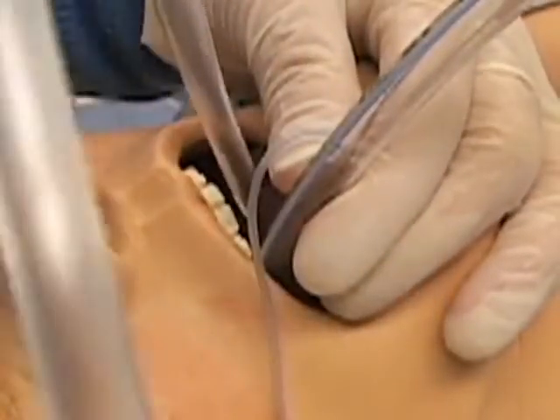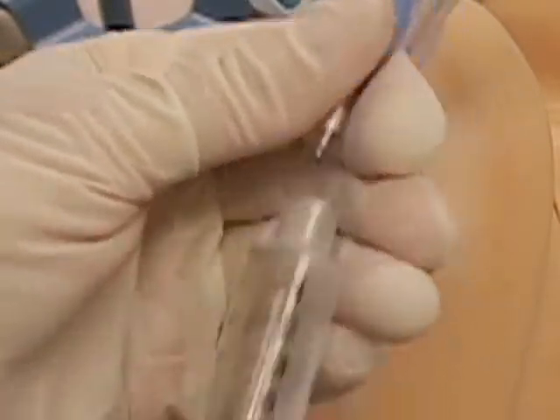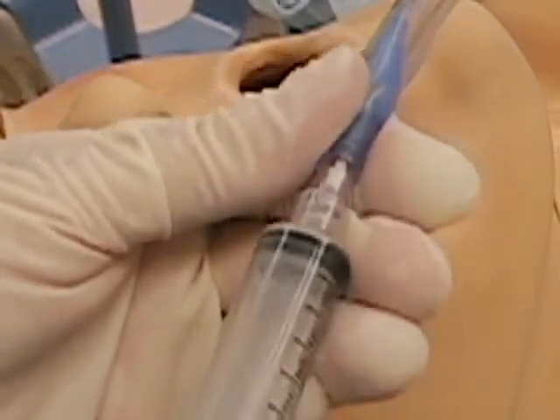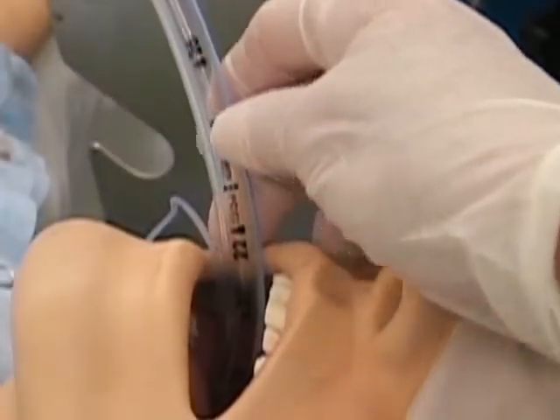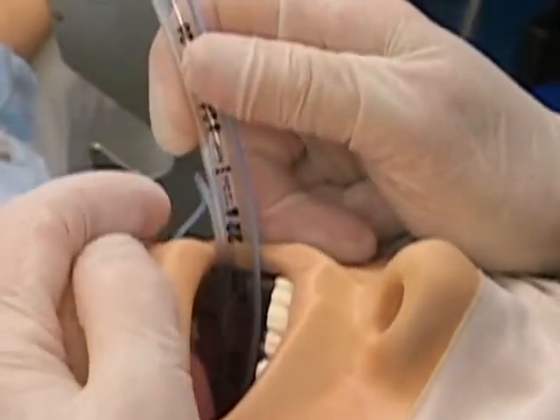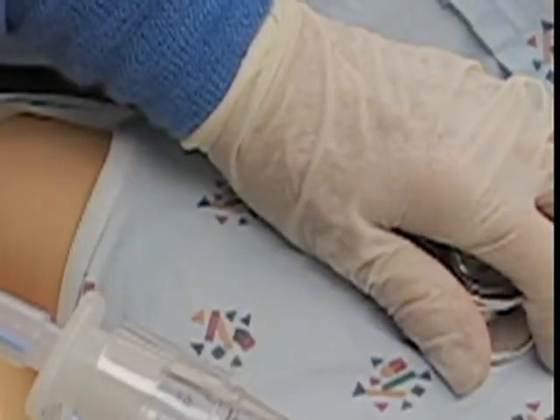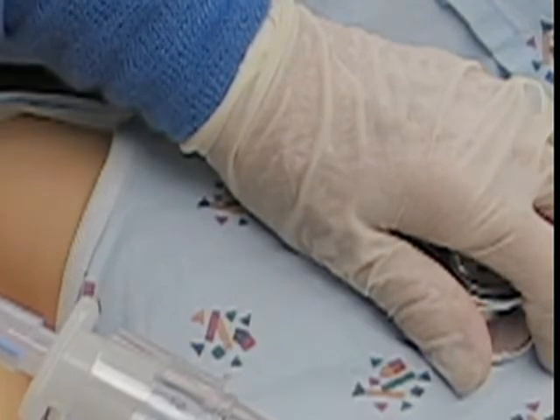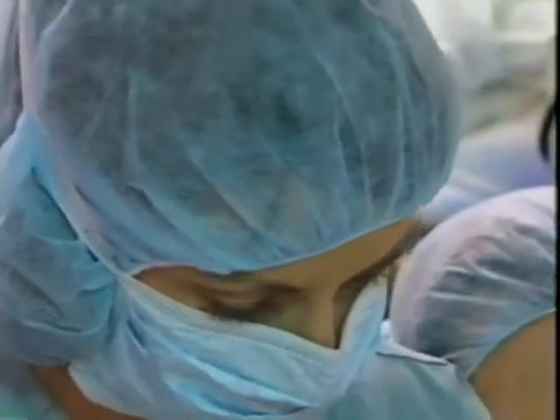Suction the patient's mouth. It may take more than one aspiration to deflate the cuff if the balloon has become overdistended with all of the attempts to seal the leak. Gently advance the tube to the proper depth. Immediately re-verify proper placement. The tube can sometimes slip off the back of the larynx into the esophagus with this manipulation.